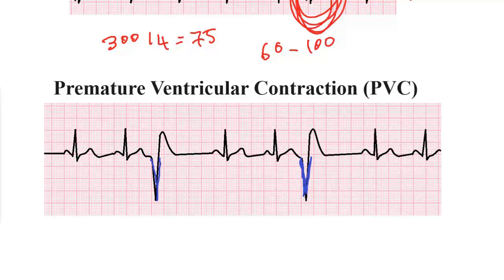All right, now that we are done with the discussion of these different EKG findings, next I would like to quickly review all of these. So if you're making any notes, you want to put them aside. The next few minutes is purely review, and you could continue going over it and listening to this section over and over until you feel comfortable with all the findings. So let me clear the board again.